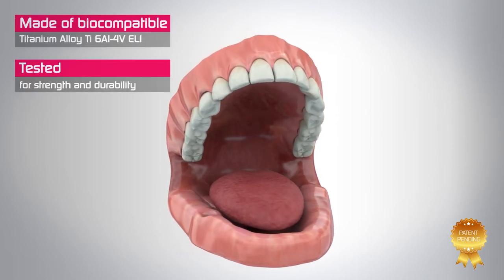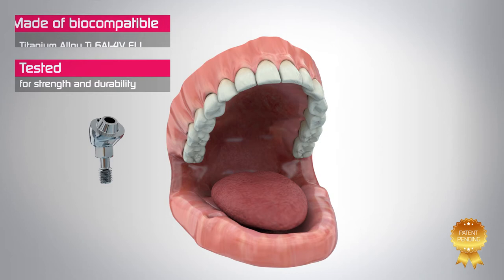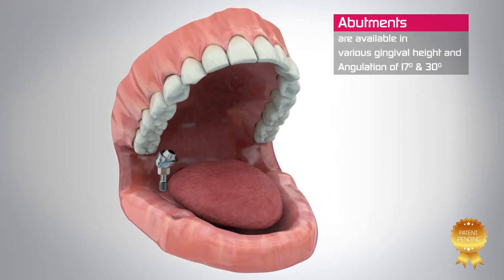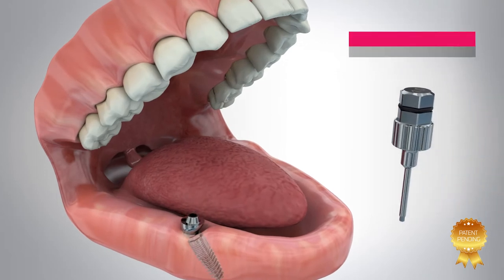This simple abutment is an excellent option to restore even compromised edentulous cases. The TAG multi-unit abutment system is the perfect solution in cases where angulation correction is required.